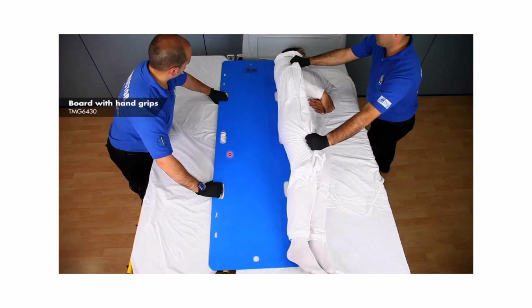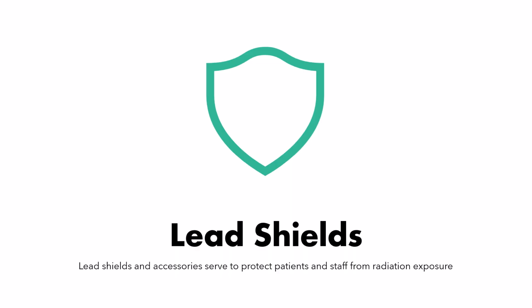This is a good example of where you have the sliding board. They're doing a log roll on this patient. I think you guys may have practiced that with Miss Lobren. You log roll the patient, you put him on here, and then you can slide the whole board or just slide the sheet and have him on this board here, on the table here.